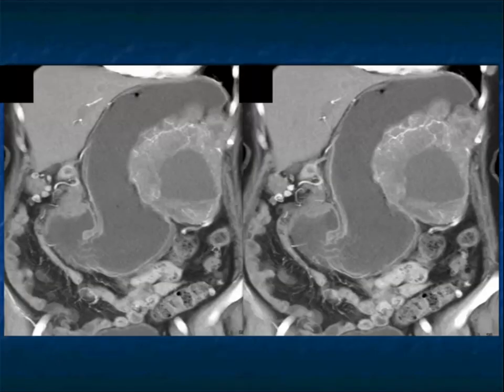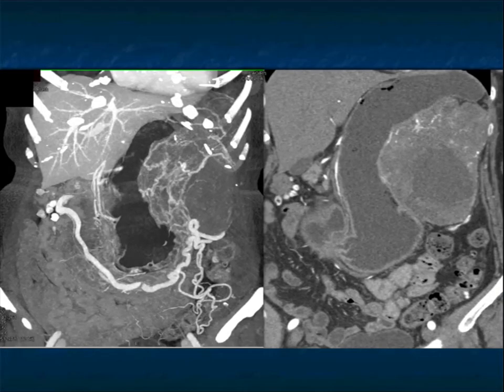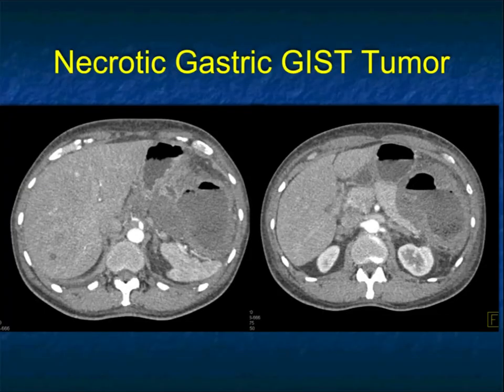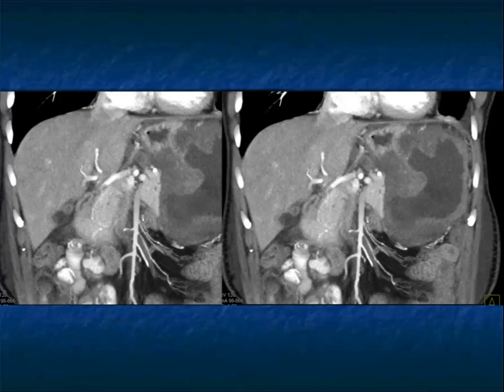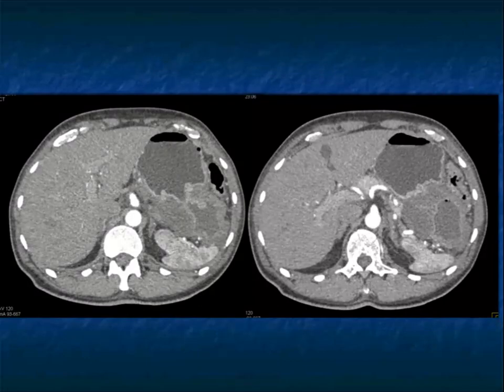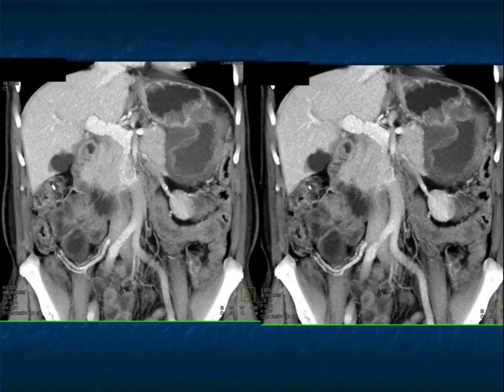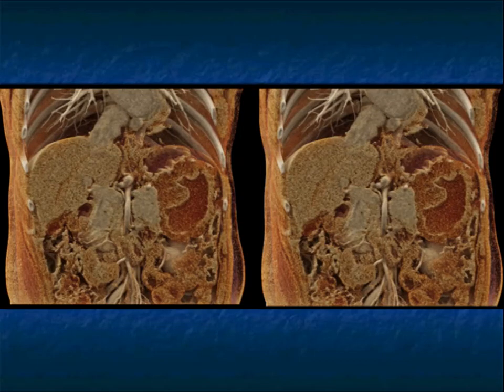Gastric GIST tumors can calcify — I'll show you examples with very dense calcification shortly. Here's a patient presenting as a GI bleed — you can see some enhancement within the lesion, large exophytic component, tumor necrosis, bulky tumor. Coronal views nicely show how the lesion sits against the stomach. These patients are treated with Gleevec and do fairly well, then will get surgery. This case shows the tumor to be fairly vascular with areas of central necrosis, shown going from MIP to volume rendering.